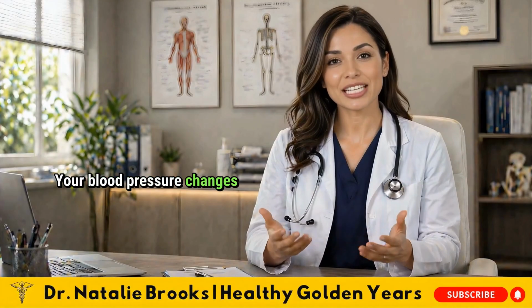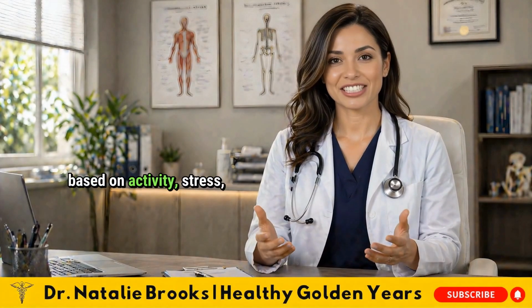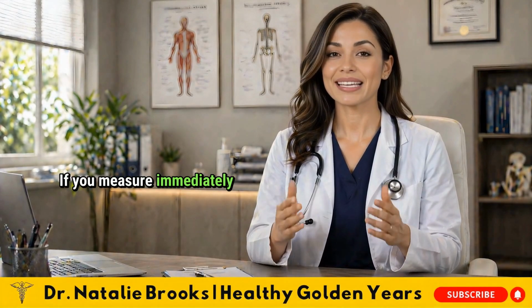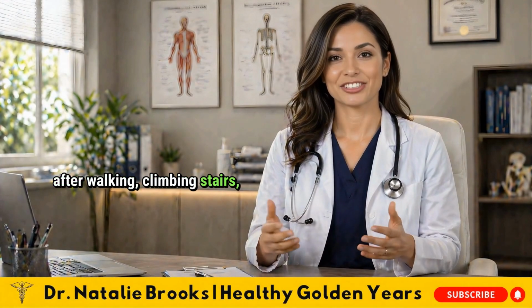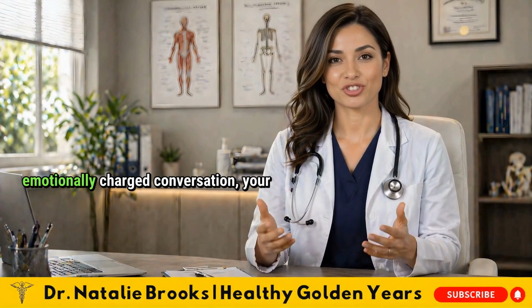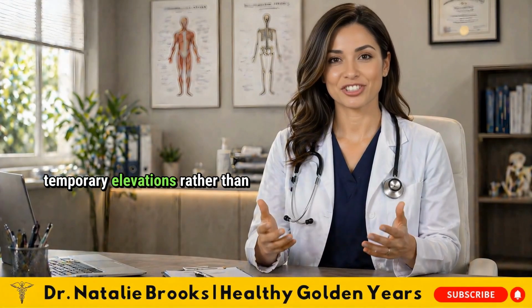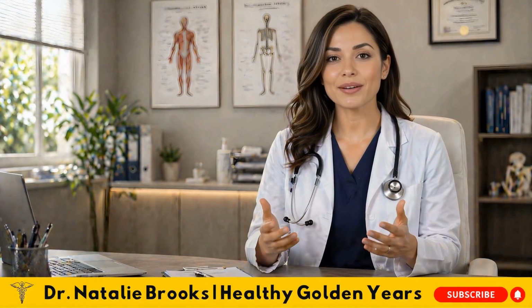Your blood pressure changes constantly throughout the day based on activity, stress, and even conversation. If you measure immediately after walking, climbing stairs, eating, or having an emotionally charged conversation, your reading will reflect those temporary elevations rather than your baseline pressure.